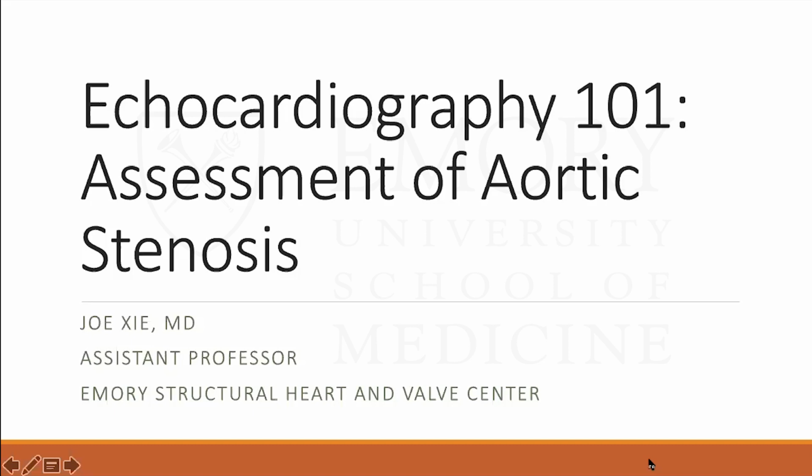Ozma invited me to give you guys a talk about aortic stenosis, and specifically echocardiographic evaluation of aortic stenosis. I tailored this talk more towards first year fellows. I think it's still early on in the year to go through some of the nitty gritty details of how to properly echo the aortic valve. But I think some of the upper level fellows can hopefully pick up a couple of things related to this as well. So we will go ahead and get started here.